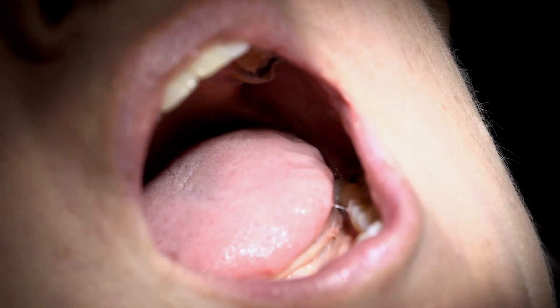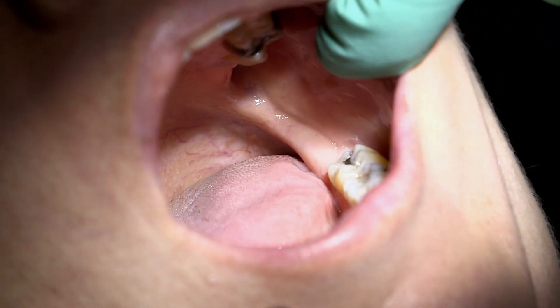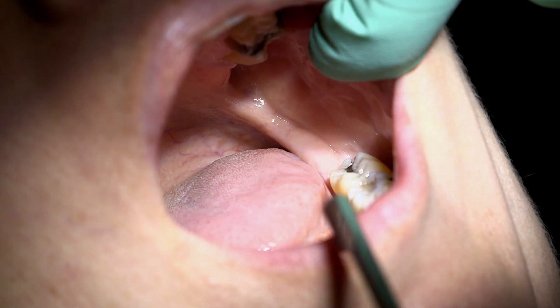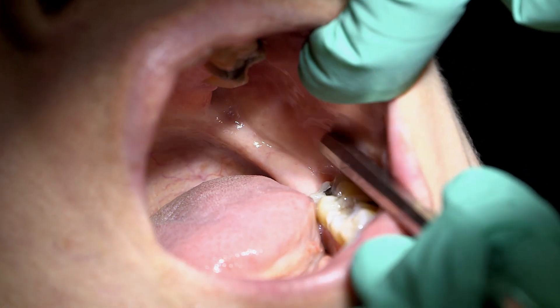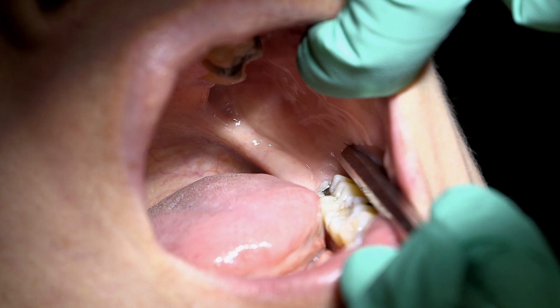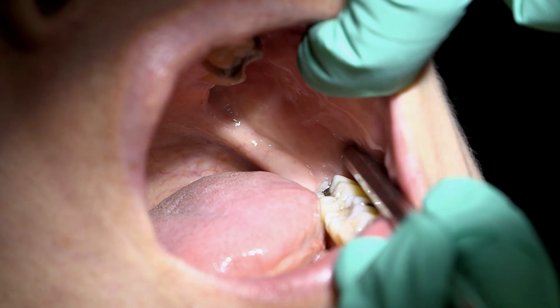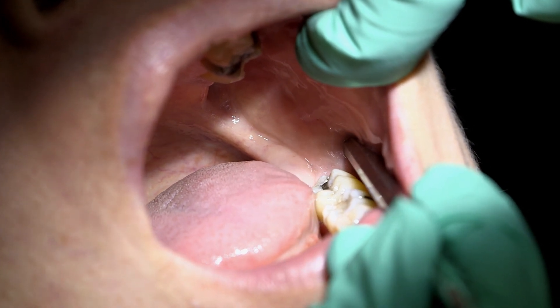We will now perform a long buccal block in quadrant 3. First we need to identify the target bony site, which is the anterior border of the ramus, and the soft tissue landmark, which is the mucous membrane distal and buccal to the last molar in the arch.